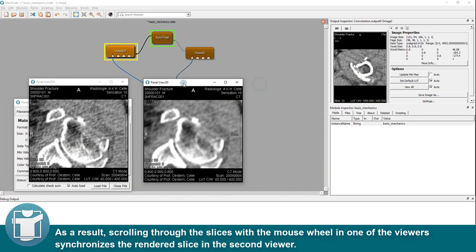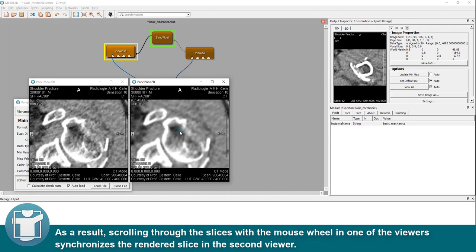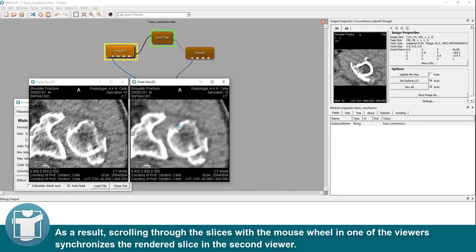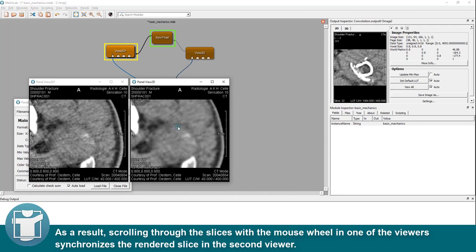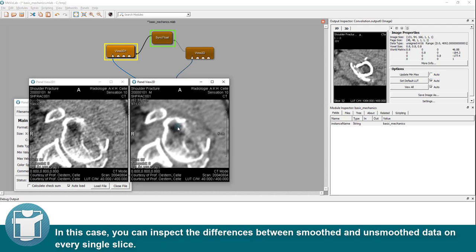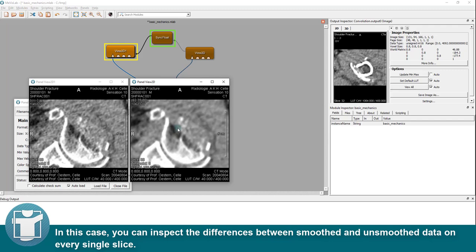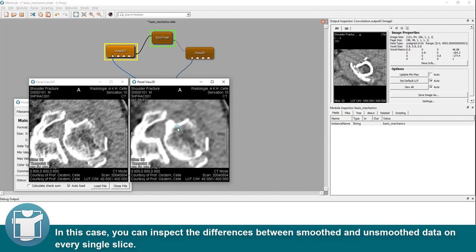As a result, scrolling through the slices with the mouse in one of the viewers synchronizes the rendered slice in the second viewer. In this case, you can inspect the differences between smoothed and unsmoothed data on every single slice.